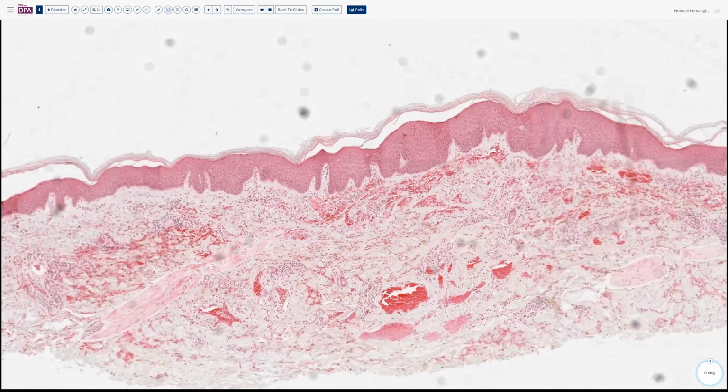We'll talk about the differential diagnosis for this, but it includes papillary lymphatic angioendothelioma, post-radiation sarcomas, and retiform hemangioendothelioma. These are also lesions which can have hobnail-type cells, but we'll talk about that differential again in the second session of this topic.